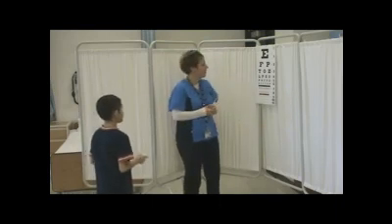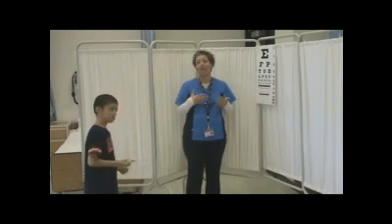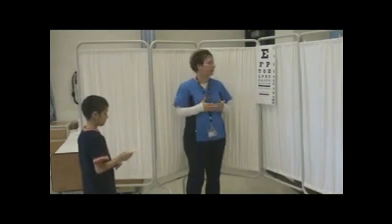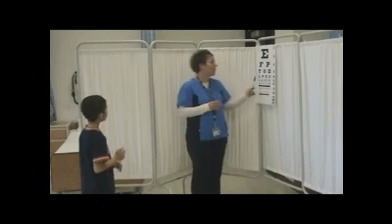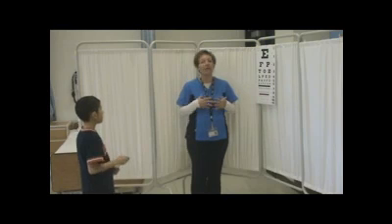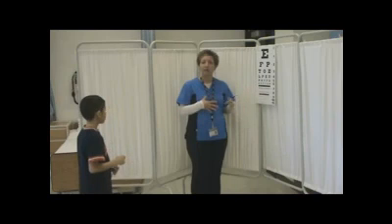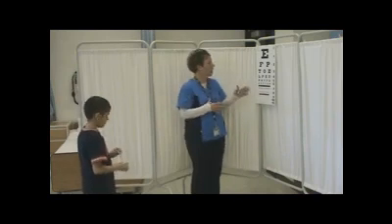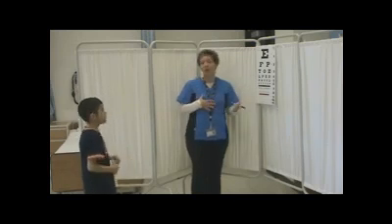It's important that we know anything greater than 20/40, we would recommend that the child have further testing, and we would follow that up with a note home to mom and dad. It's also important to note that we're watching the facial expressions of the children, looking for any squinting or hesitation. You want to allow them enough time on each letter to identify and give the response, but don't linger too long. Also, you don't want to suggest whether they have gotten the right or the wrong answer.